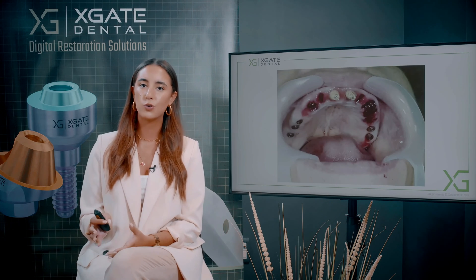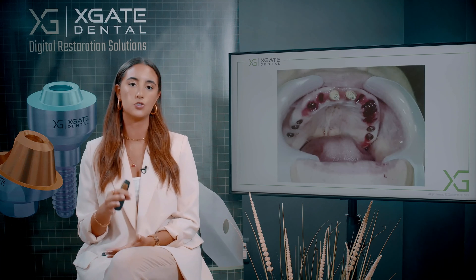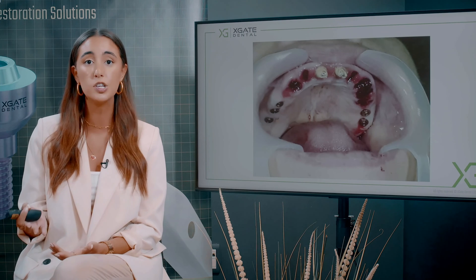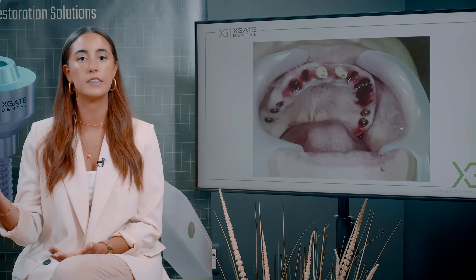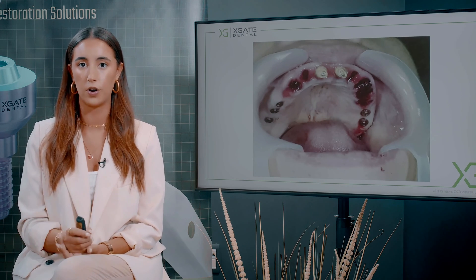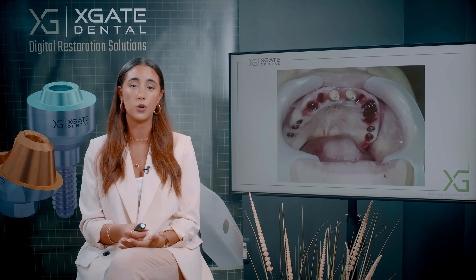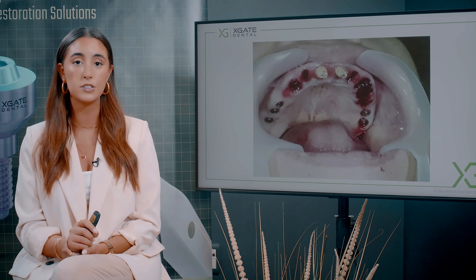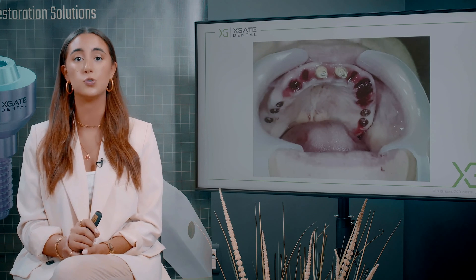What we chose to do is extract those teeth and leave for now the two central incisors, because for the provisional temporary restoration you want to make the restoration on those implants. But you can't make a horseshoe shape without any anterior support — it will press on the gingiva and can harm the implants installed above. So we kept those two teeth remaining and made a bridge with two implants on one side, three on the other, and the frontal area on two teeth.